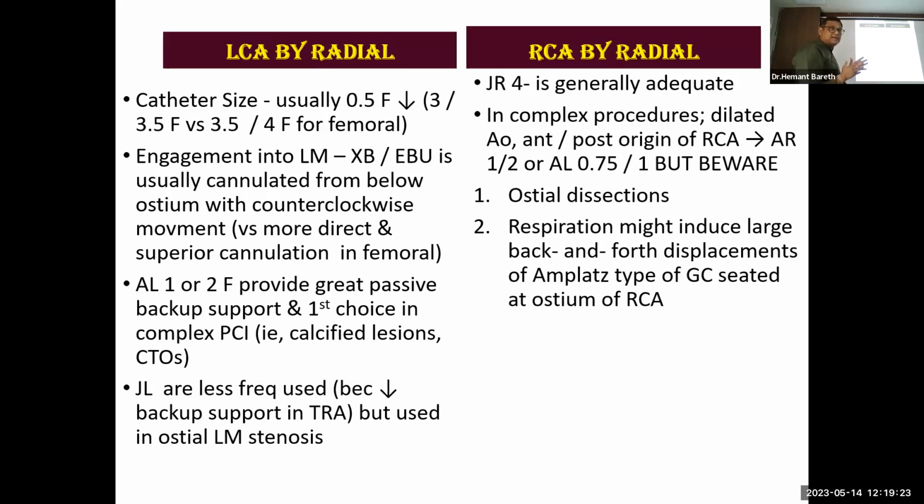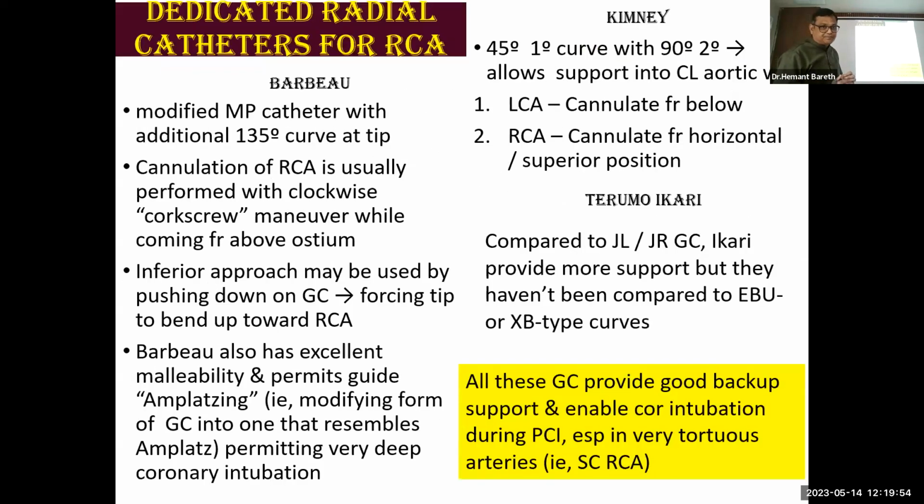But with the Amplatz, as I said, the problem is that the tip keeps moving. Unless you keep an eye on the tip throughout the procedure, you might land in ostial dissection. With respiration also, because the tip is not fixed, the angle can open up and the tip size can increase. So not only side to side, it can also move forward and backward. A lot of back and forth movement can happen, and all of these can injure the coronary ostium.